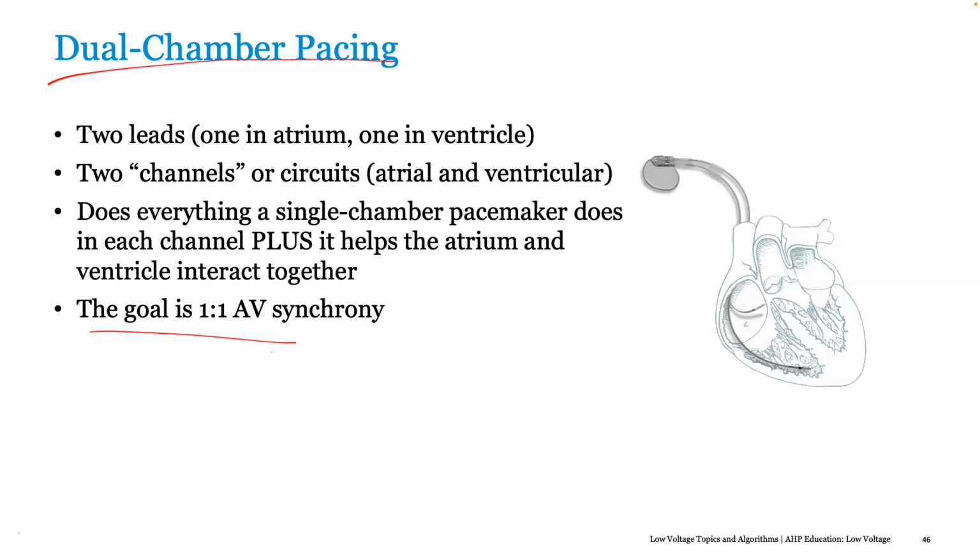So really, your atrial lead's only going to give you a bit of atrial information, which is going to tell you that they're in atrial fibrillation, which you already know anyway. So I don't think an atrial lead is worthwhile in these patients. Personally, we put in an RV and an LV lead and cap the atrial port with just a little pin port plug. The second thing is, again, it depends on the level of device that you have.